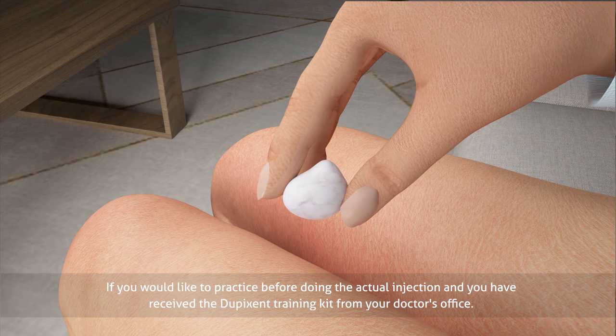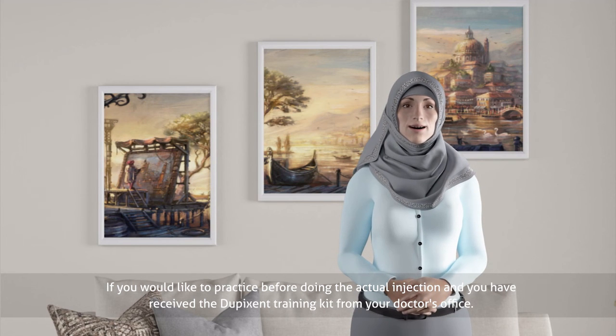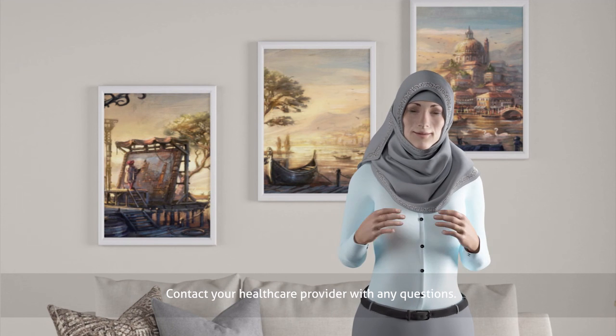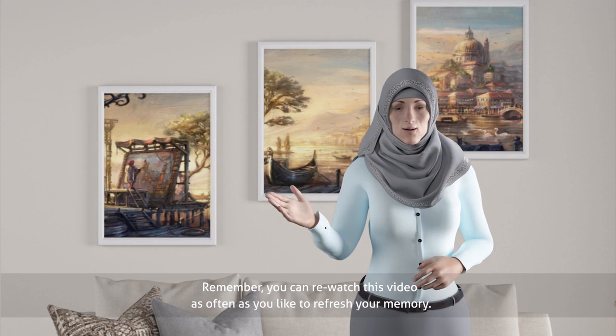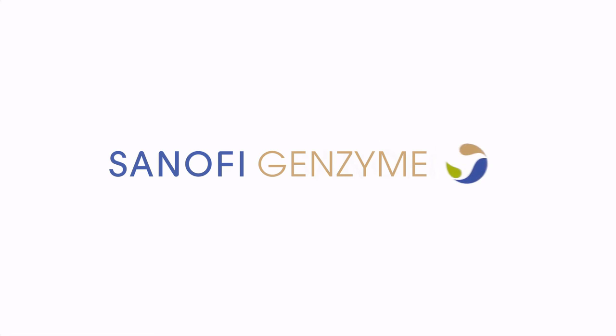If you would like to practice before doing the actual injection and you have received the Dupixent training kit from your doctor's office, you can practice the 45 degree injection angle with your training syringe, and you could always watch the video again. Contact your healthcare provider with any questions. Be sure to keep track of your injection date and site. Thank you for joining me today. Remember you can re-watch this video as often as you like to refresh your memory.